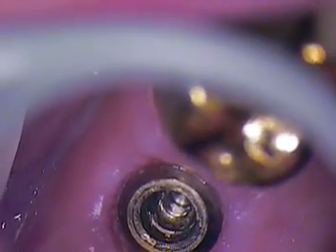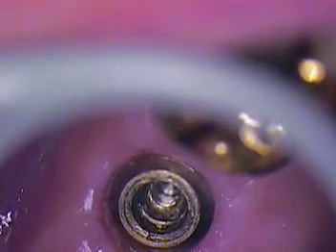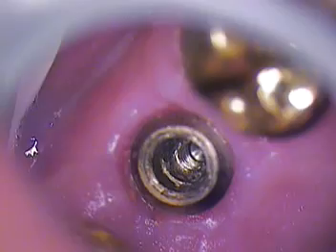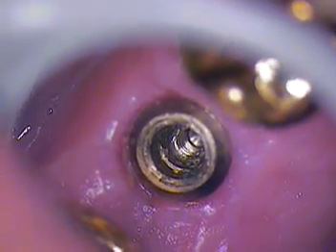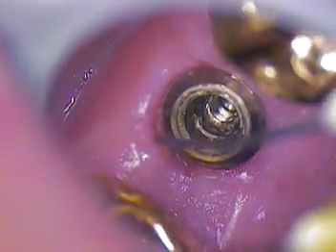So we're going to use something called a micro suction tip. And John, can you see that pretty well? Yeah. So that's the inside. And I'm going to show you the internal anatomy. Now he coats this with a lot of antibiotic material. It's a clear gel. Some of the surgeons will use an oxygel to prevent oxidation above. Looks like he got this one right on the button. Looks great as far as vertical height.